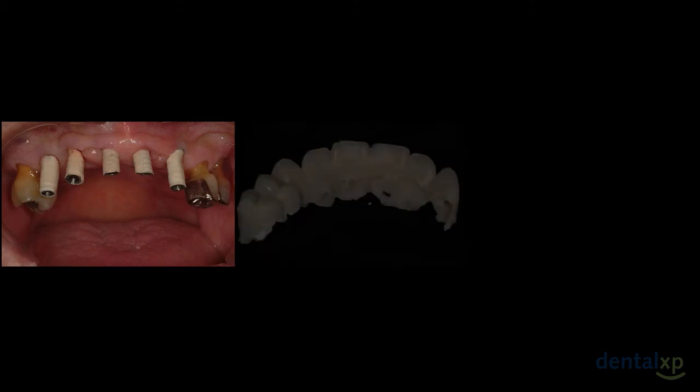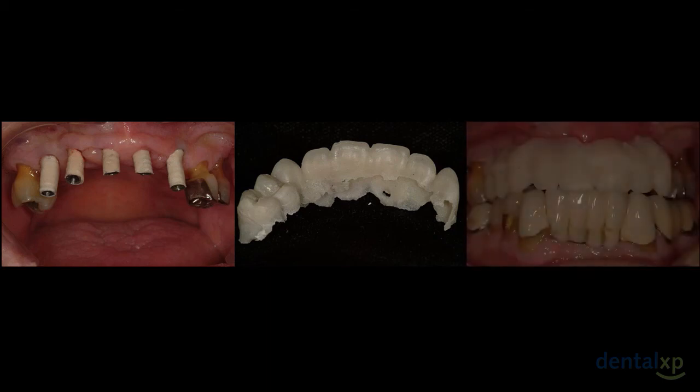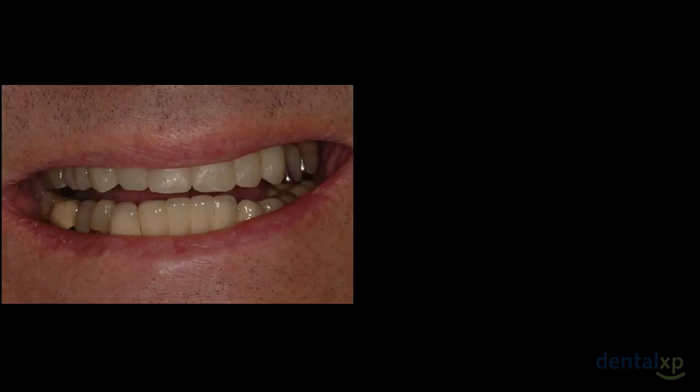After the second stage surgery, we then fabricated a provisional restoration so we can start the healing process of the soft tissues. With this type of prosthesis, accurate implant placement is crucial so we can understand where the prosthesis is, based upon the implant placement.